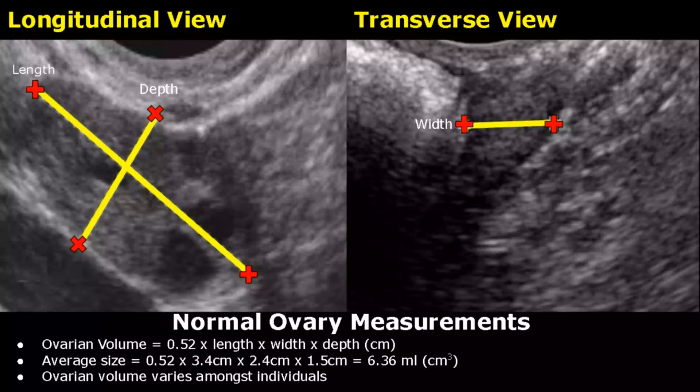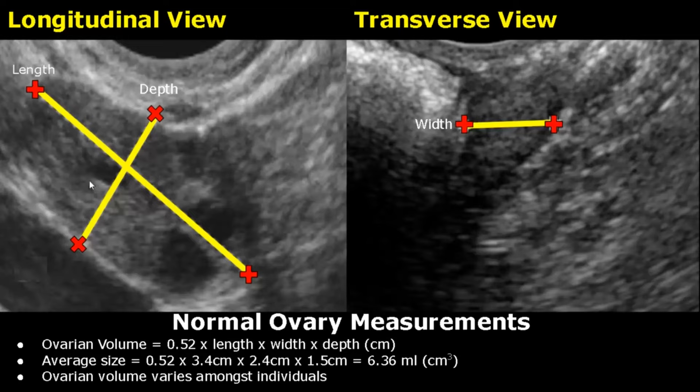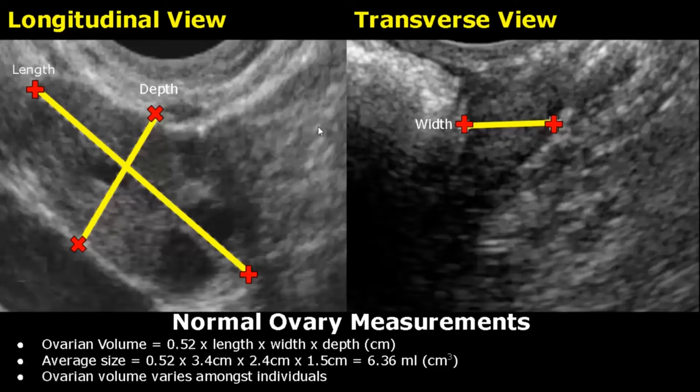Hello everyone, this is Dr. Sam and in this video we will learn how to measure ovarian volume. The formula for measuring ovarian volume is: 0.52 × length × width × depth, all values in centimeters. These are transvaginal images — the measurements are more accurate in this approach.